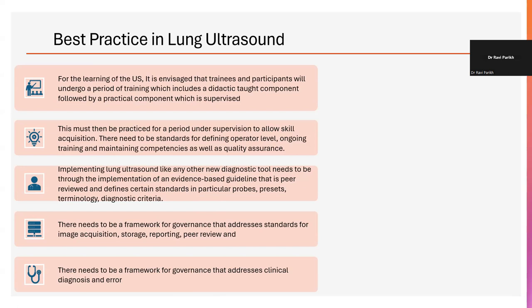Now, if you do not have a guideline and a governance framework when you start doing that in the unit, and you're the only person who's practicing that, you open yourself up to risk. You open yourself up to questions, because naturally there are people who will be doing x-rays on your unit.